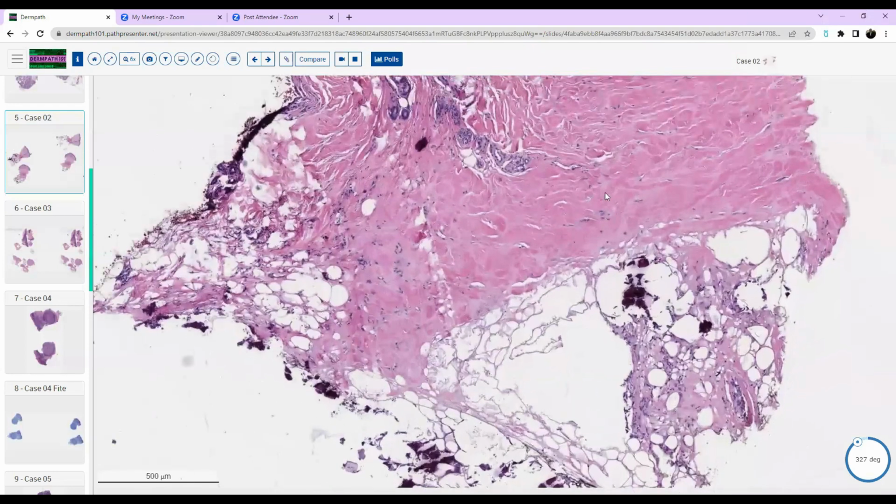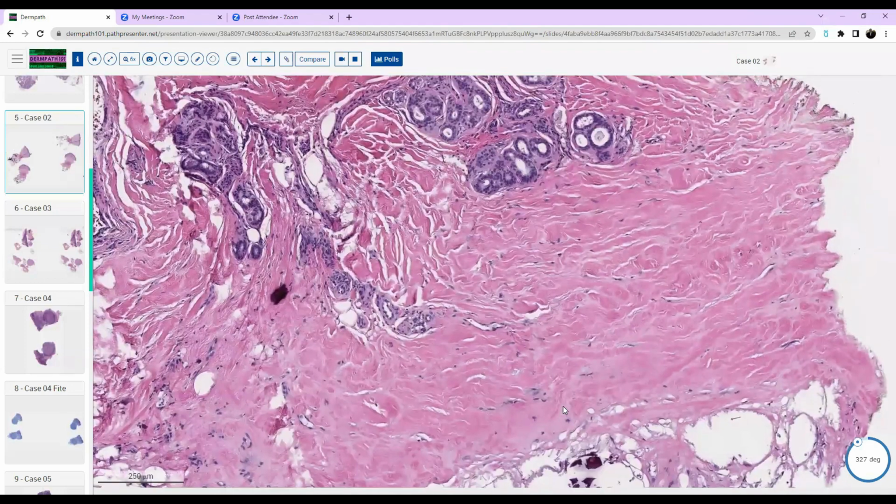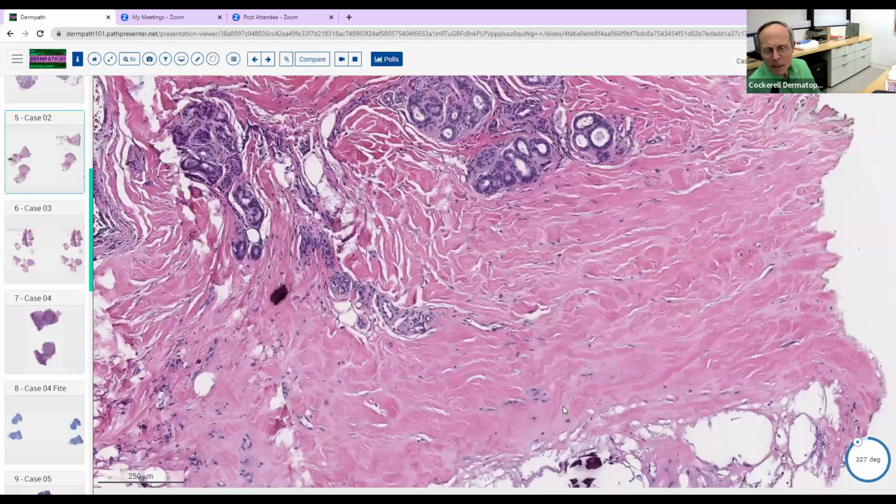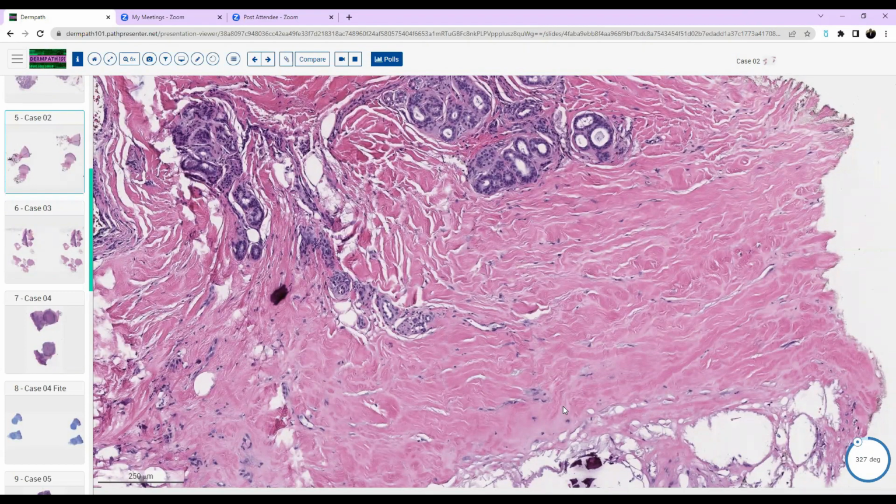Yes. With the sclerosis, something else I was thinking about was scleredema, because there was mucin as well, but in scleredema, the mucin in the dermis wouldn't be as much as the calcium in the bottom. Yeah, you don't really see dystrophic calcification, and you don't really see that membranous fat necrosis in scleredema either.